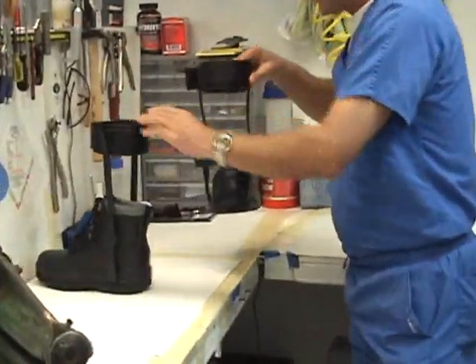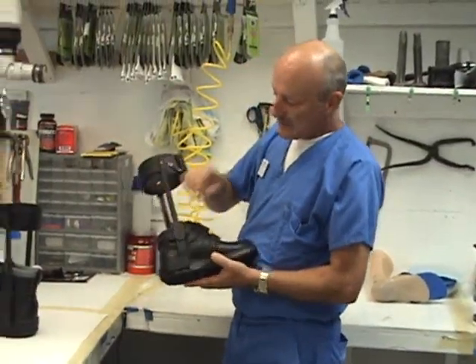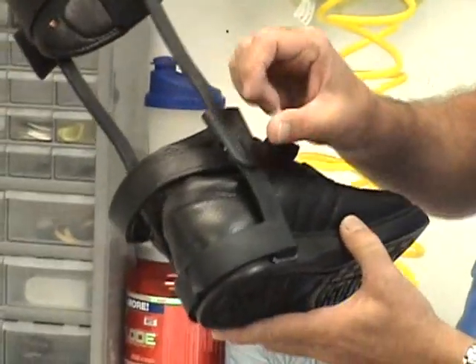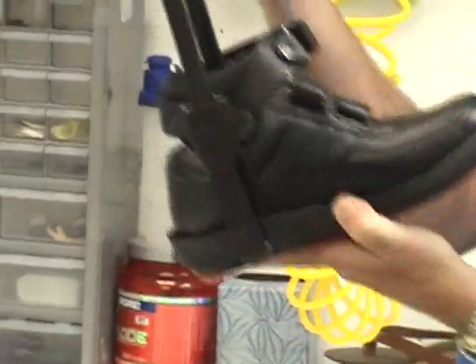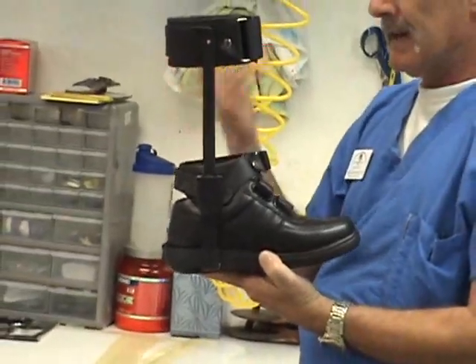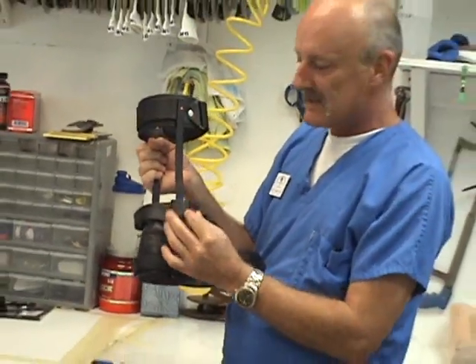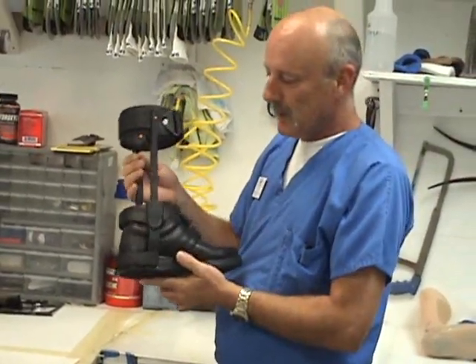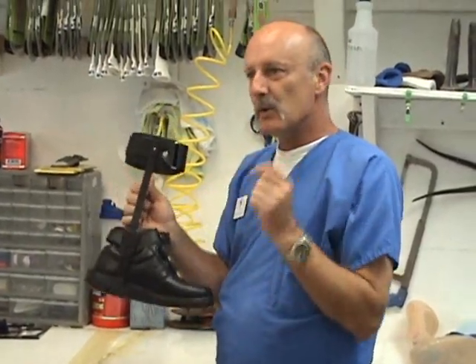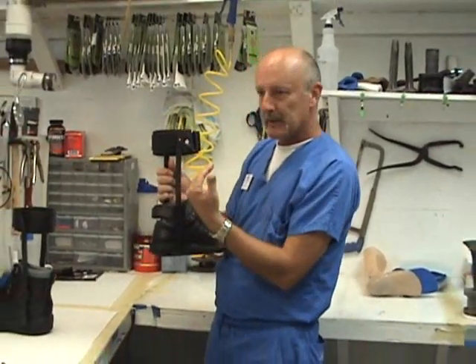I prefer when I do a limited motion to use a double action joint, which has screws and channels where you can put metal steel pins in so you can position the leg and get better alignment at fitting. The problem with double action is the head needs to be steel, so it adds a little bit of weight. But I think it's worth that extra weight for better function, better alignment, and gait.